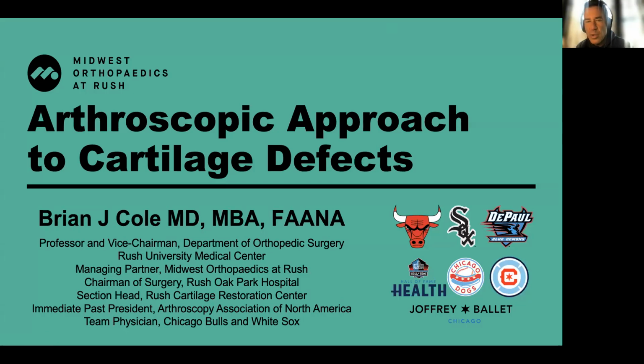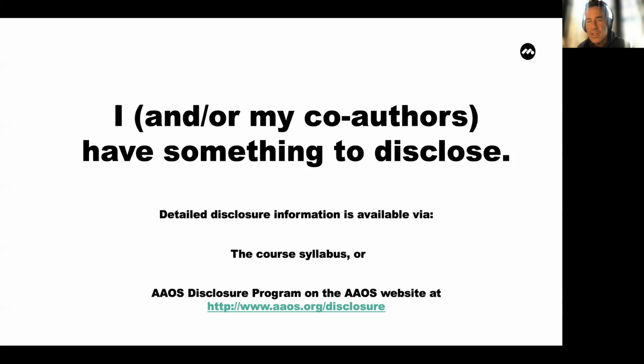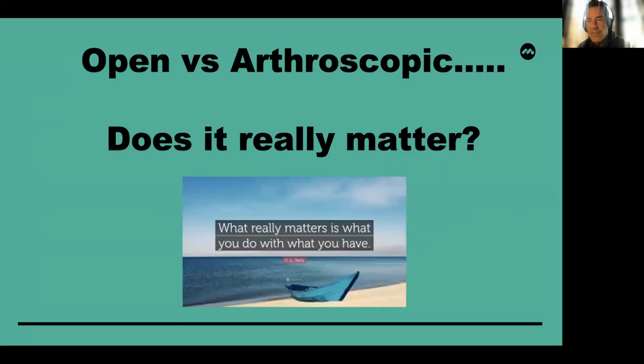Hello, I'm Dr. Brian Cole, and over the next few minutes, I'm going to present the arthroscopic approach to the management of articular cartilage defects. I think the first question that we need to ask ourselves is, does it really matter whether we approach an articular cartilage problem in an open fashion or an arthroscopic fashion?